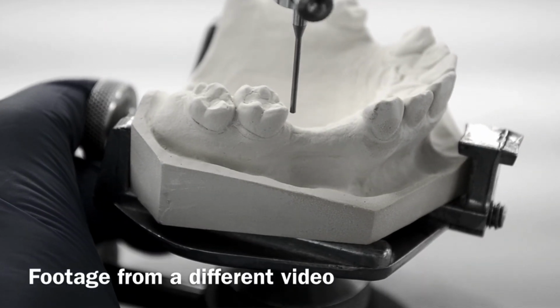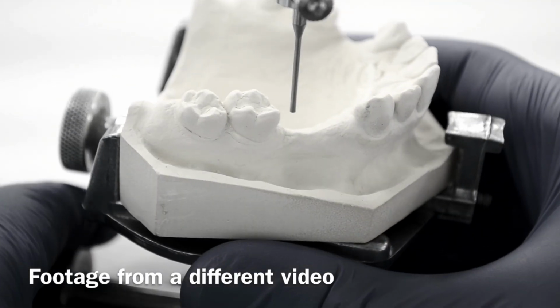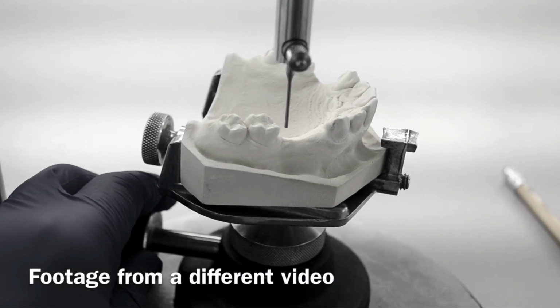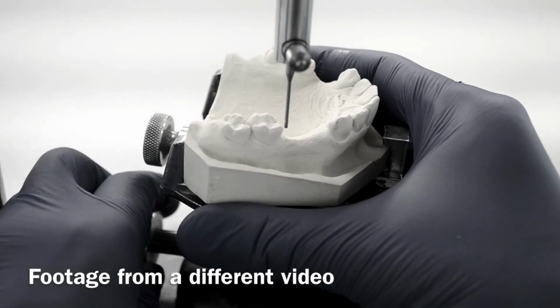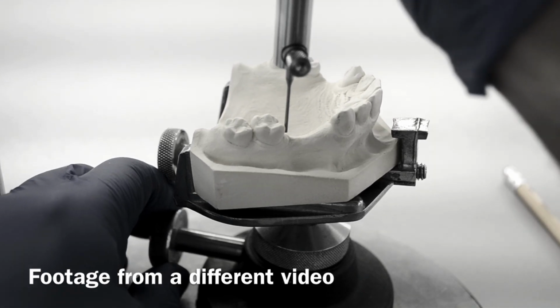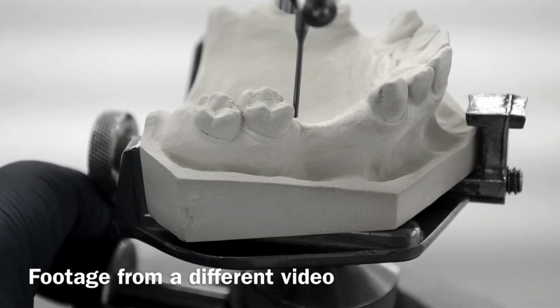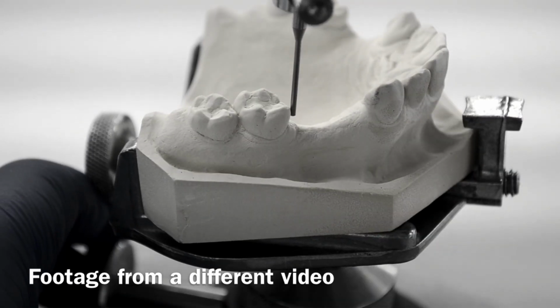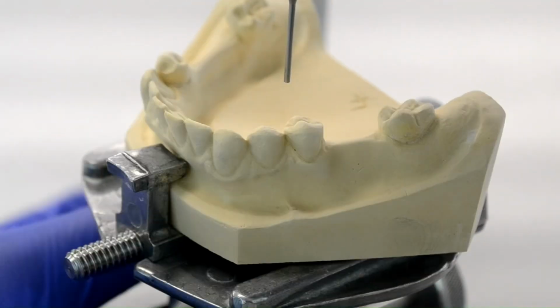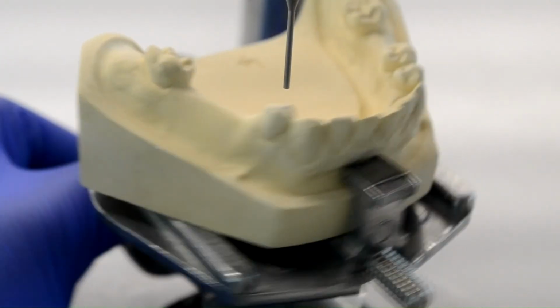As we get the analyzing rod in contact with a surface to be adjusted, a space might appear gingival to the contact point. This means that the angle of the surface to be adjusted does not match the angle chosen for the path of draw, and this would require some adjustment onto that abutment. To minimize this adjustment, we might need to tilt the table in order to change that path of draw so that that surface would better align with the chosen path of draw and minimize the amount of adjustments needed. For this Mandibular Class III case, it seems like the current path of draw is adequate for all abutments and no tipping will be necessary.